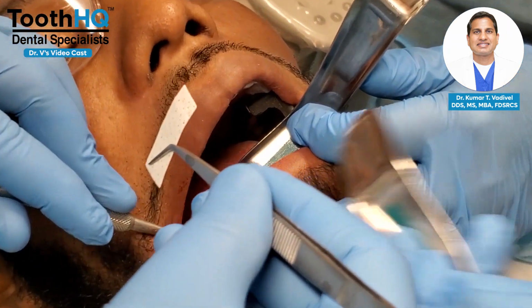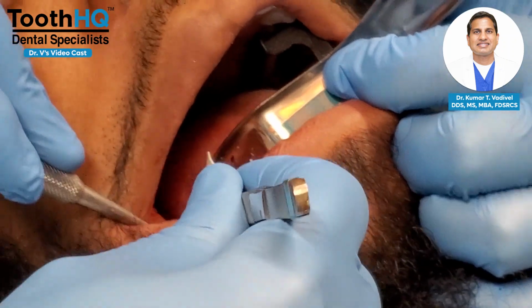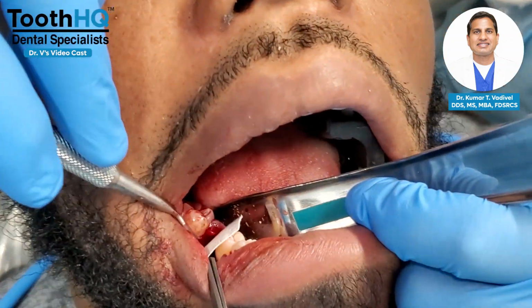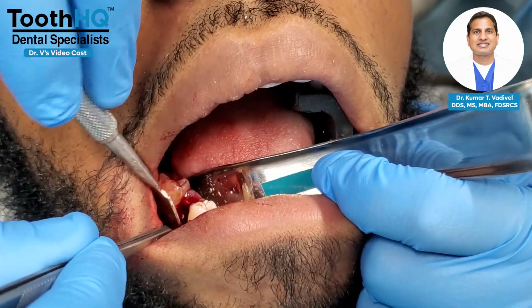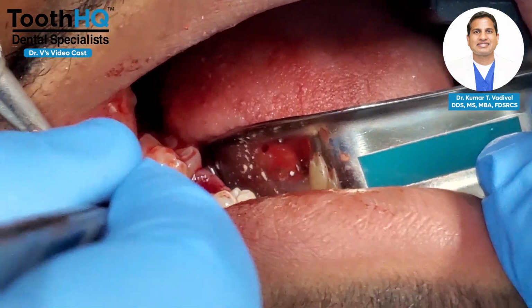So now, suction please. And I'm going to put the membrane. I know it's kind of hard for you guys to see. I'm going to slide the membrane in between. This is the buccal flap here. So what I did was I already relieved the buccal flap all the way down here.